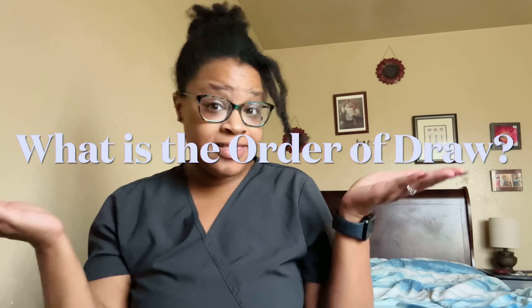Okay, so what is the order of draw? The order of draw is pretty much the correct or precise order of blood that you are going to draw from a patient and the right tubes it's supposed to go into. In layman's terms, it means this is the test you are going to draw and this is the color tube it's supposed to go into.